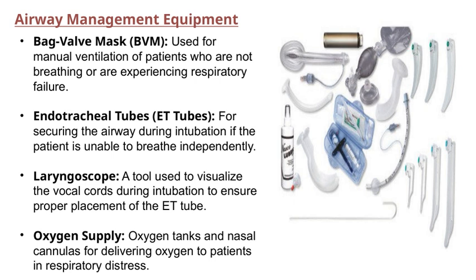All of these tools are interconnected and play a vital role in airway management, which is a cornerstone of emergency care. By understanding how and when to use each piece of equipment, we can improve patient outcomes significantly.